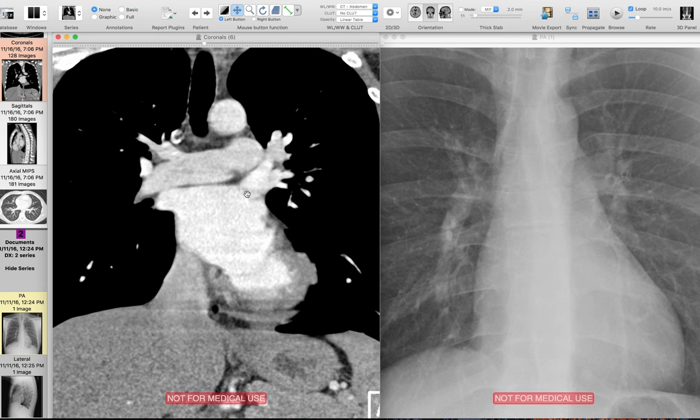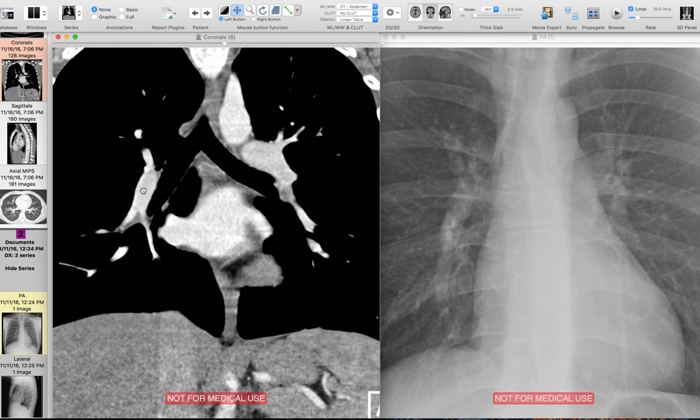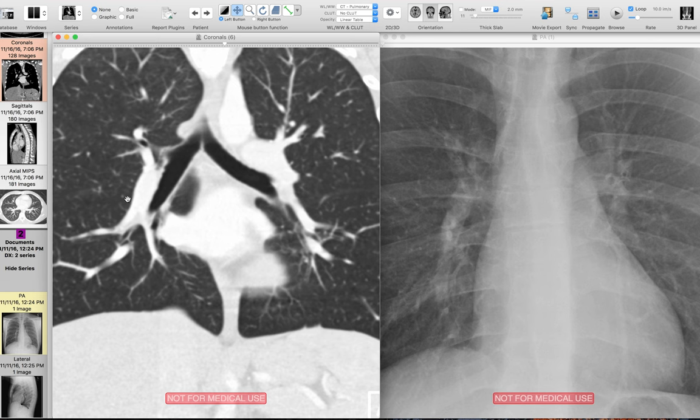If we look at the corresponding CT, this is the main pulmonary artery. It divides off into the right side — this part goes up into the right upper lobe, and this right here is the right interlobar pulmonary artery. You can see why it's visible on the chest x-ray: it is right next to normal lung. This is our manifestation of the silhouette sign — normal lung next to the water density of the artery.